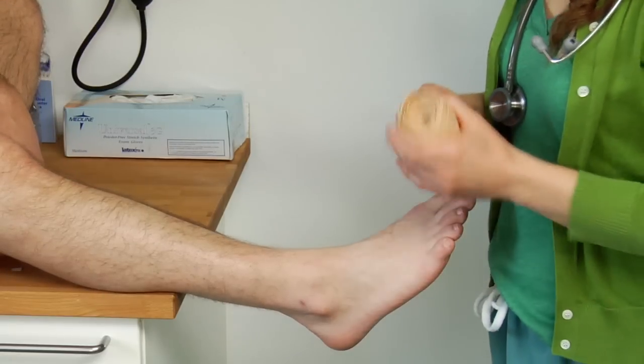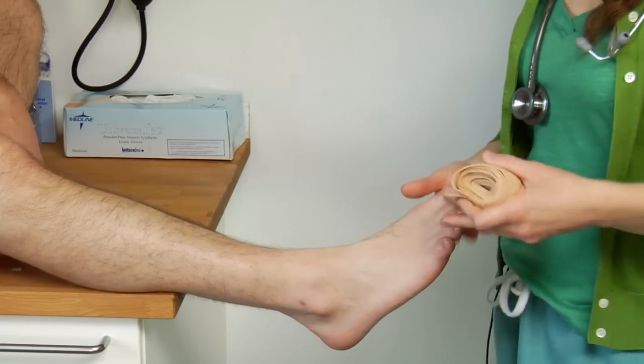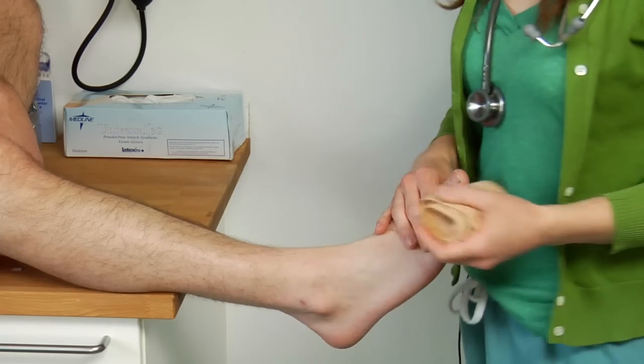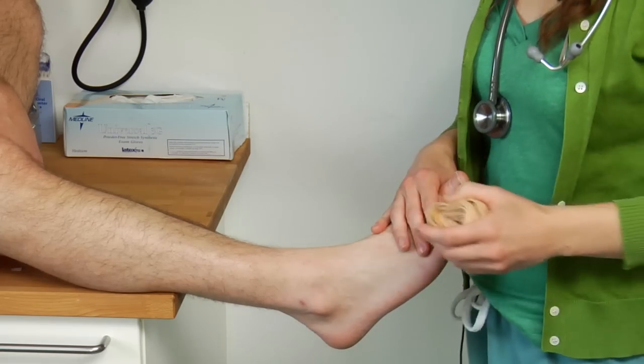The first thing you want to do is collect your supplies and get yourself in a position where you can wrap the ankle of the person best. Take off the sock they're wearing and make sure they don't have any debris that you're going to wrap into the bandage, which could cause further injury.